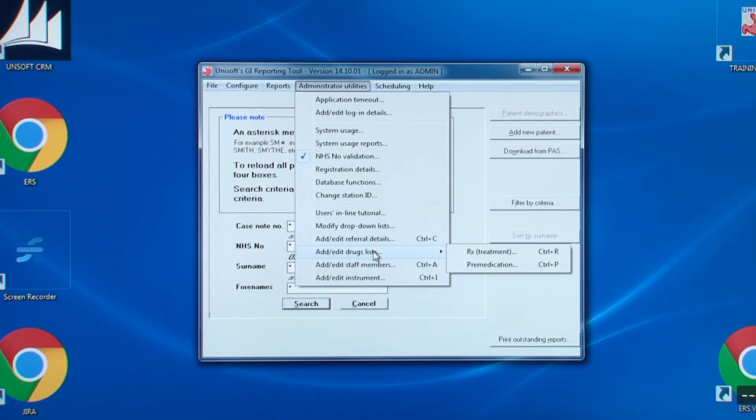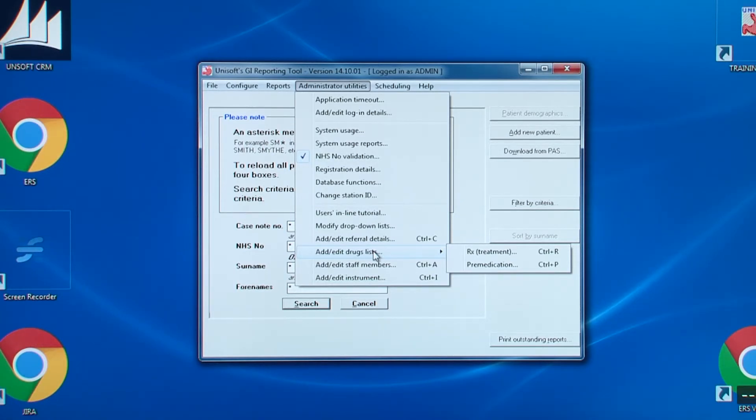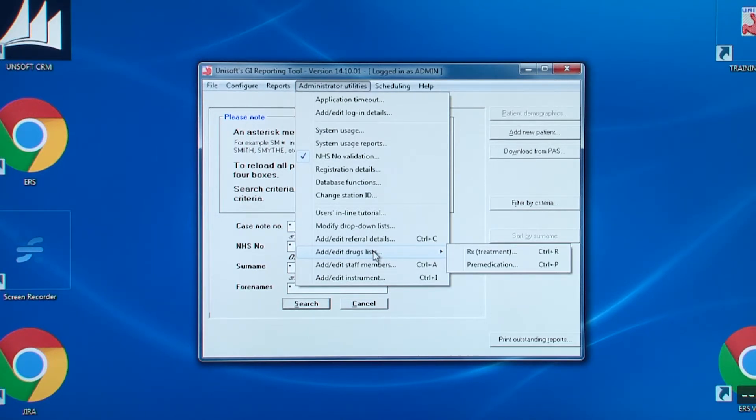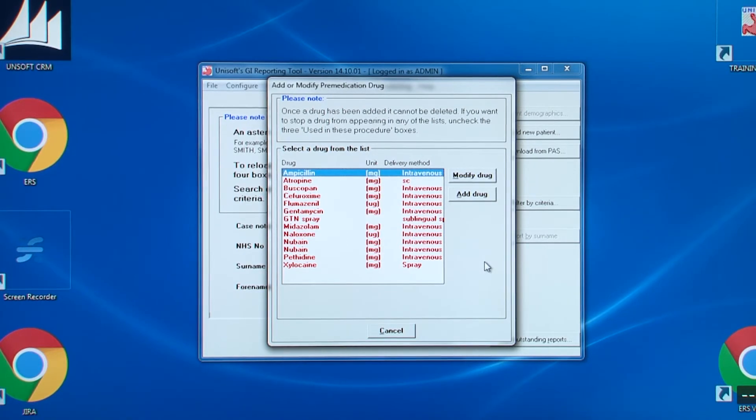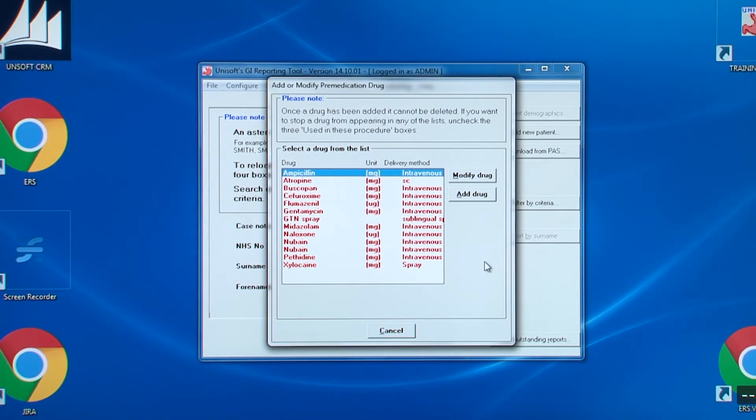This is to do with maintaining the list of drugs. We differentiate between drugs prescribed for treatment and those used by the endoscopist during the procedure. Both lists work in the same way, so we'll choose the pre-meds. Here you can see the pre-slash perioperative drugs already on the system.